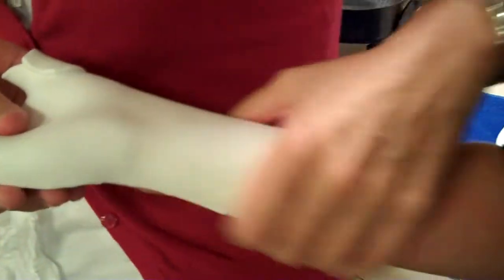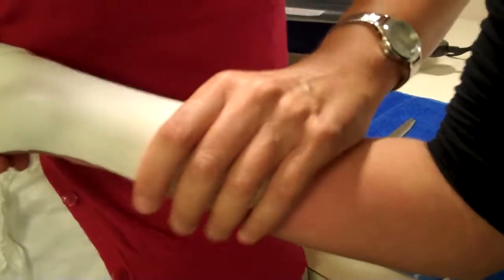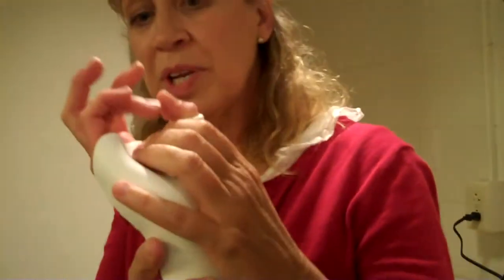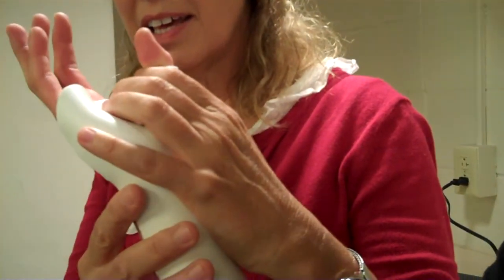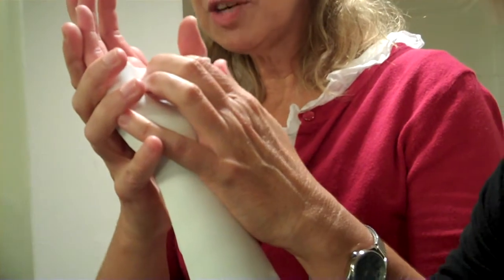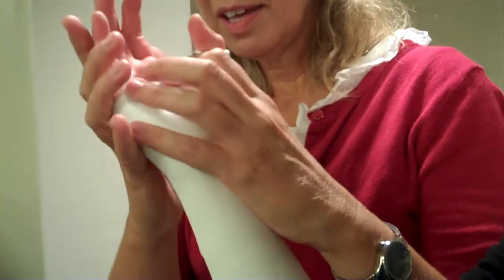But this is how you learn. So I'm sorry it's so cold, and the sides are too long. Is her thumb okay where it's at, the position of her thumb? What do you guys think? It looks like it's up a little high. It looks like it's up high, as in you want it down here more? Yeah. Okay, so she can move it.